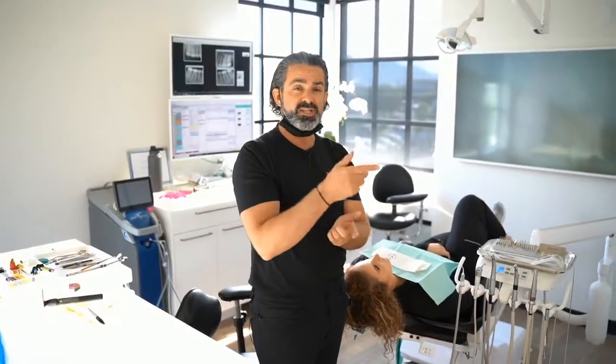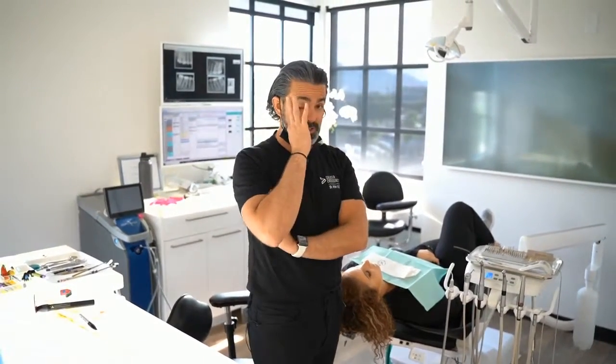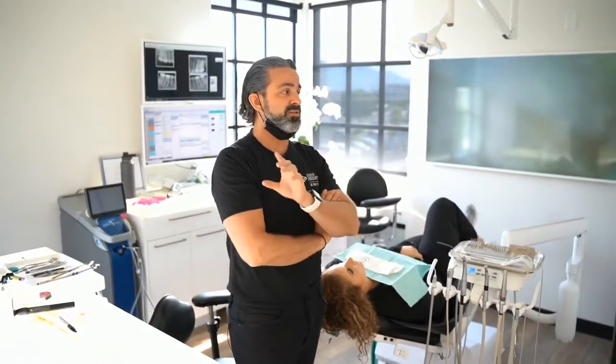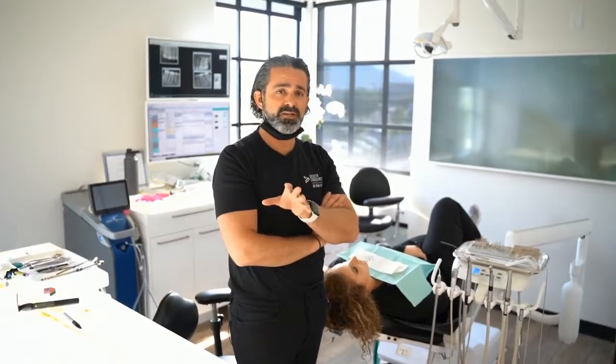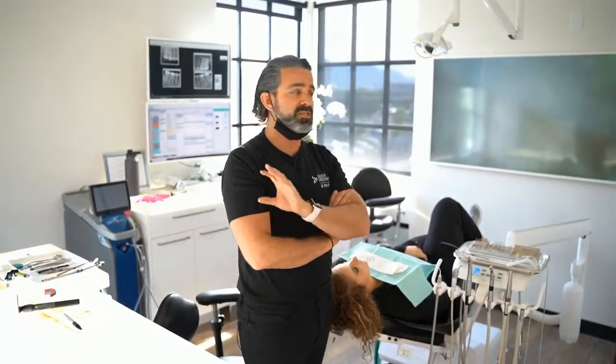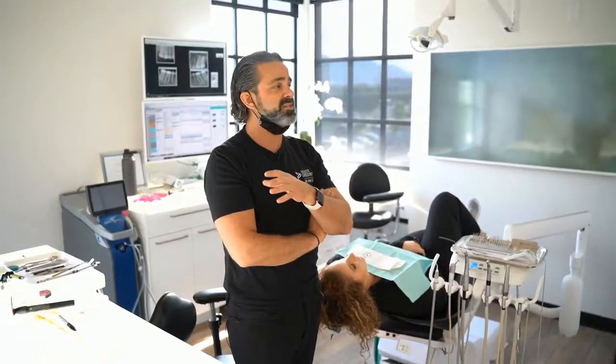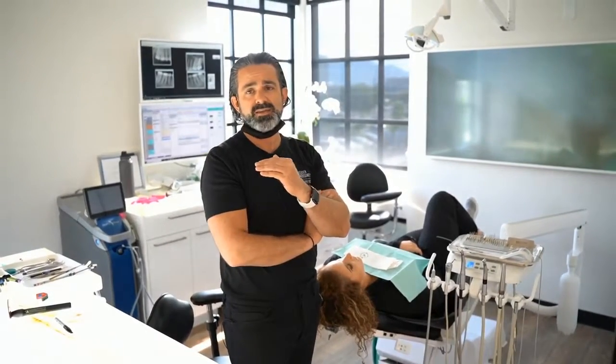When I was doing my rotation in endodontics, we had microscopes, and I was just attracted to that. It just made sense for me, and I pushed really hard to standardize that at my dental school. When I was a resident, we got microscopes all the way across the room in all the endo rooms, which is what happened. So as an endodontist, I was trained in residency under a microscope and then my whole career.